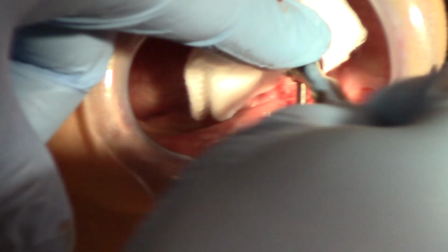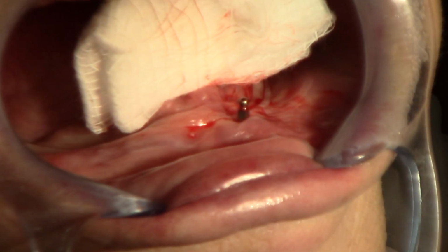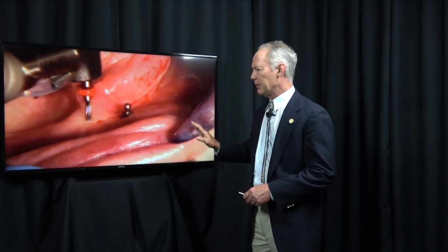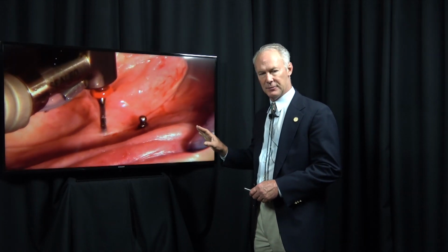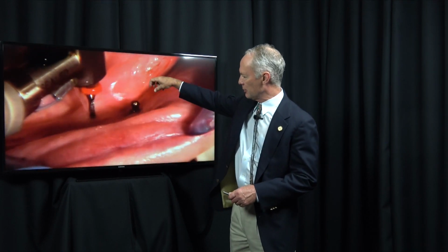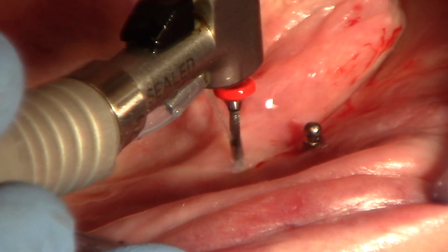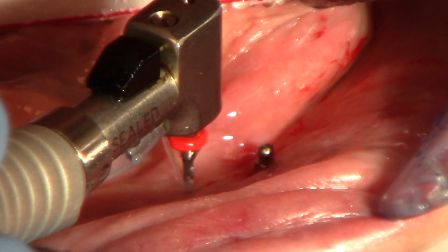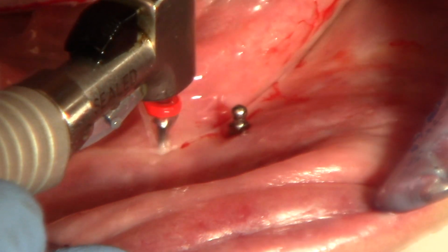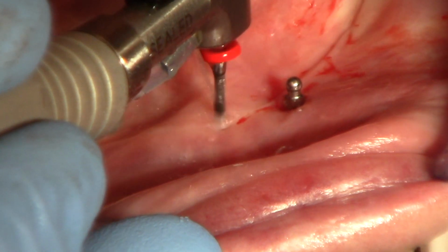If you do, the implant is not going to integrate and you should remove it and move to a different location. So I'm not worried about 35 Newton centimeters of torque. What I am concerned with though, I don't want to be able to screw the implant any further into the bone with the little finger wrench or finger driver. It should take the winged wrench or the ratchet wrench to screw it in any further once you've put it in place.